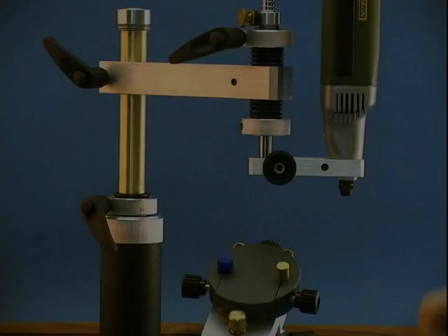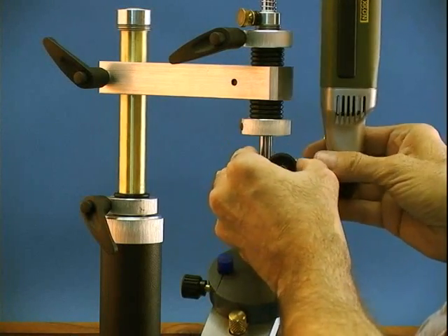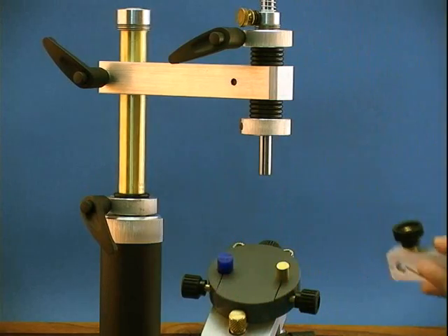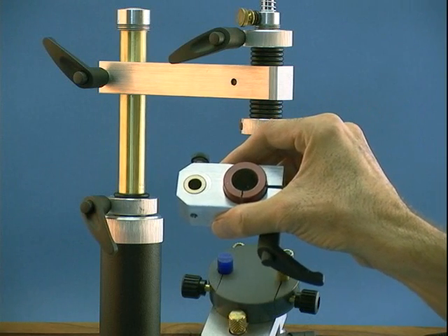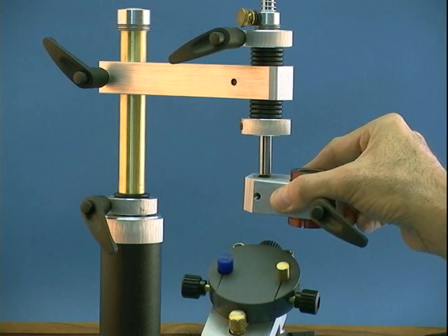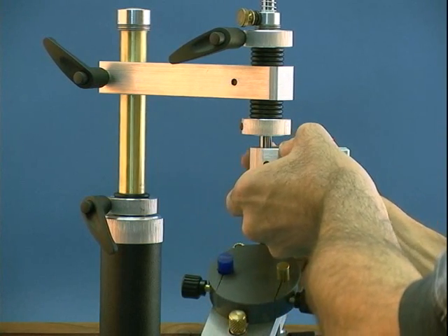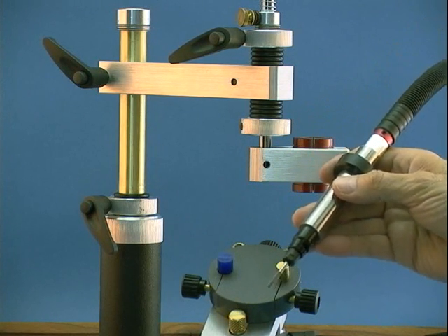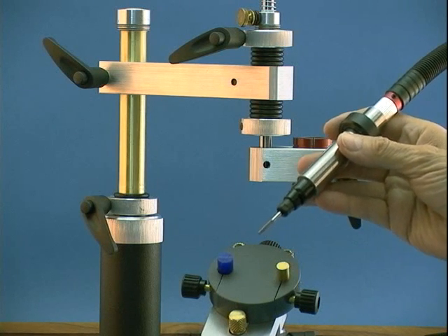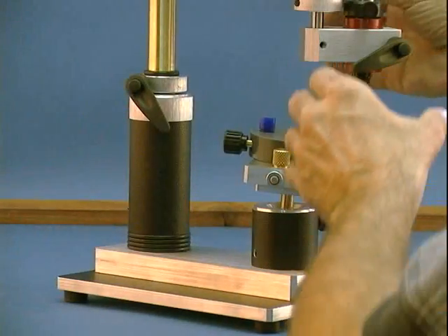We'll start by removing the electric motor and its arm, and replace it with the arm for the high speed air motor. The ground disc you see mounted in the model holder is our practice model. If you go to our video page, you can see more on its application. This is the high speed air motor that originally came with the MX-5. Removing the air motor and its arm takes only seconds.